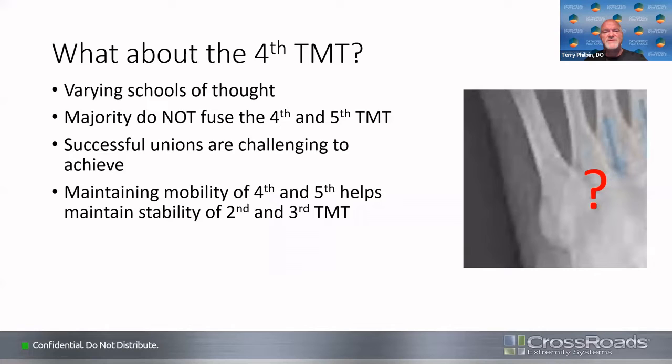What about the 4th TMT? We'll discuss this tonight. There can be some different schools of thought, but a lot of people like to leave those joints supple and moving. A lot of times, if you can achieve good stability in a case of arthritis to the 2nd and 3rd TMT, a lot of times keeping those joints mobile.